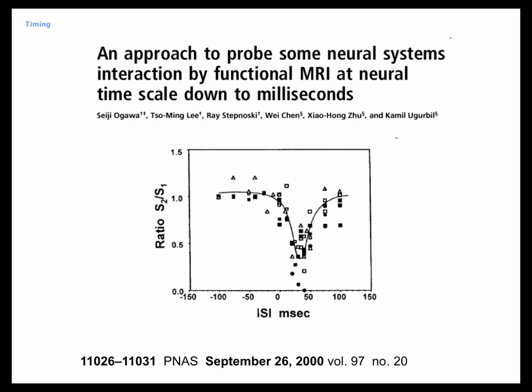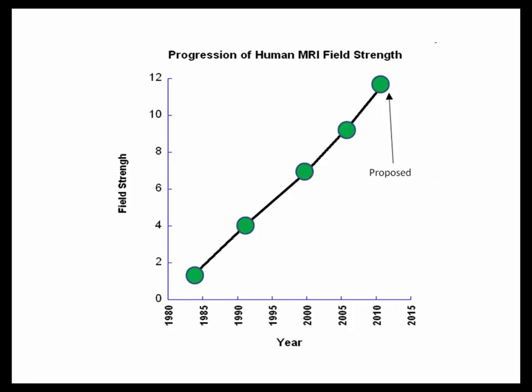You can probably look at one or the other with this timing modulations potentially. Okay, lastly, sensitivity. Not too much I really want to say here other than we're trying very hard to increase our sensitivity. We're always up against signal to noise problems.